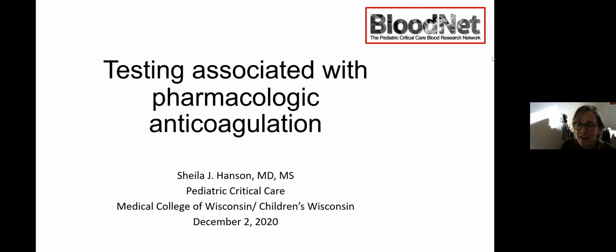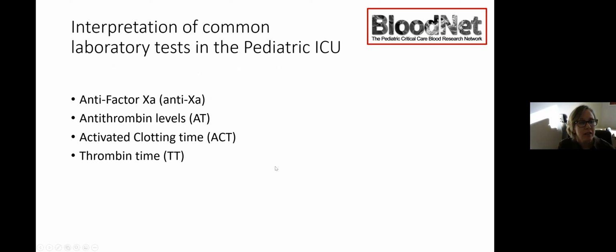Hello. Thank you, bringing back the far past with the engineering life that I had. I'm going to jump right into this, and we'll be talking about testing that's associated with measuring pharmacologic anticoagulation. I'm going to quickly cover in the time allotted some of the common laboratory tests that we use in the ICU, specifically anti-factor 10A, which will be abbreviated anti-10A, antithrombin levels, AT, activated clotting time, ACT, and thrombin time I'll go through briefly because Guy did just such a great job on that.